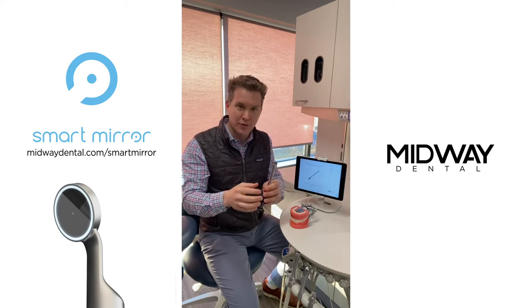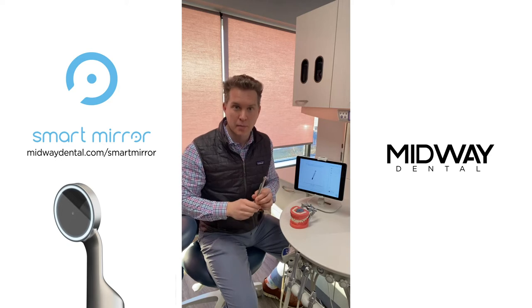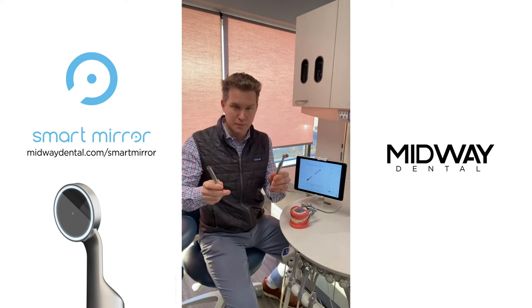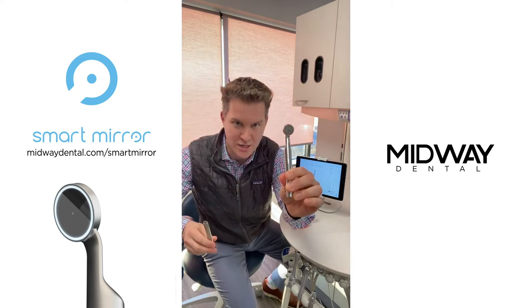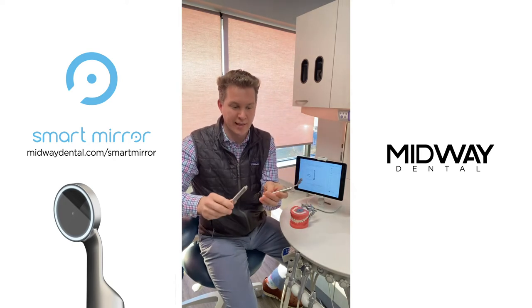Today I'm going to give you a quick breakdown and demo of what it's all about and then I'm going to tell you how you can get your hands on one. The smart mirror is comprised of this, which is the mirror, and this component which is the streamer, essentially the electronics.